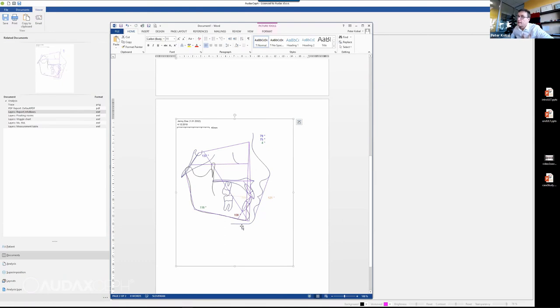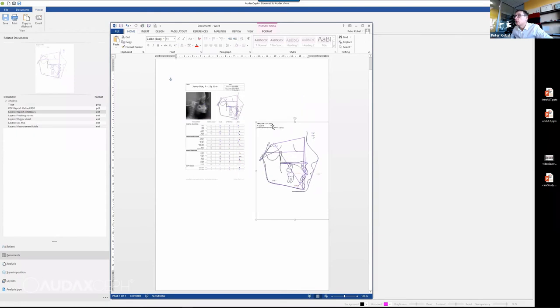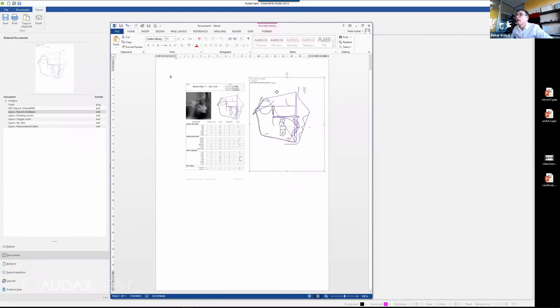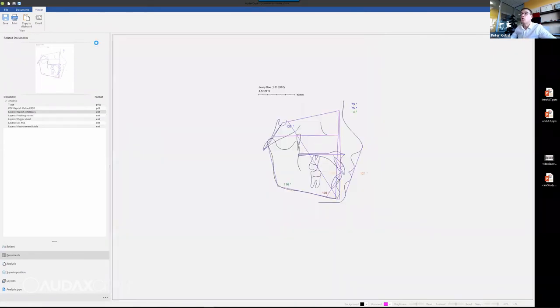One thing which is great here is that if I resize that, it will always be smooth. So these are vector curves and they will always be smooth. You can make it even, I don't know, bigger, one meter times 2 meter, it will always be smooth. And I will use some tools here to position that to the first side, but these are tools developed in Word. So you can always copy paste anything to other applications.